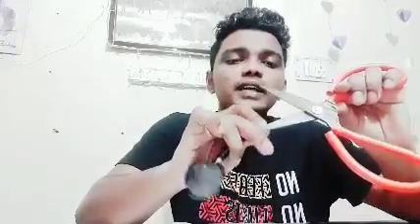This is the original mic that's there, and you have to keep this mic inside this thing. The thing is, it won't fit in. The diameter of this is really thick, so you have to groove it up, so you have to trim this down. For this, I used a pair of scissors and just insert it and rotate it. It would trim the edges, it will thin it out. And then you can get your microphone now.